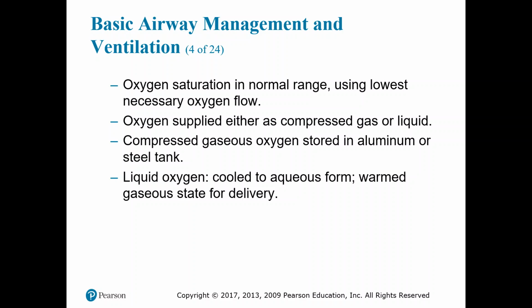So that again is tank pressure in PSI multiplied by 0.16 divided by liters per minute.